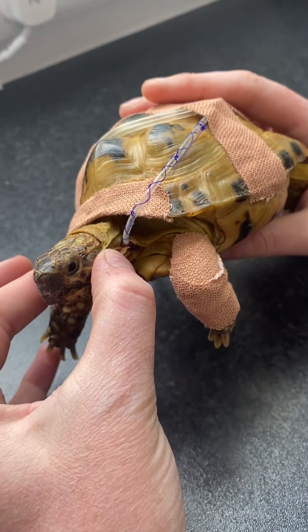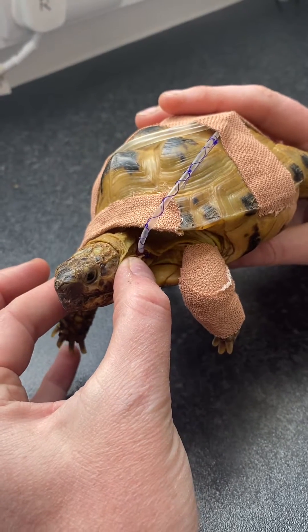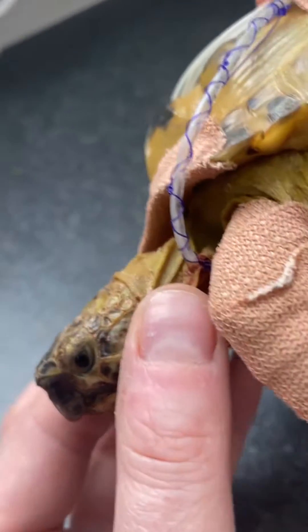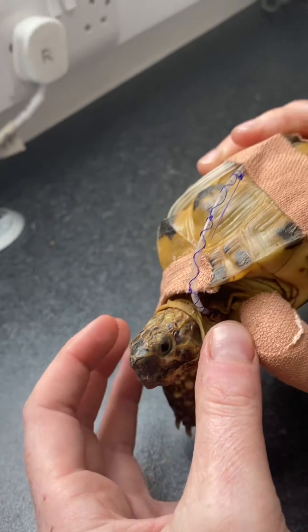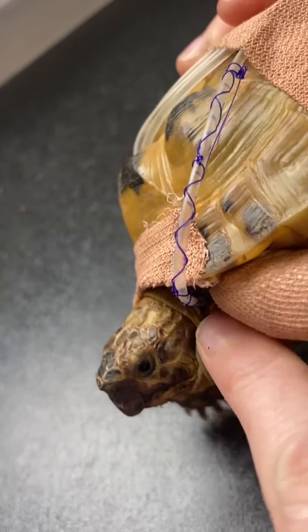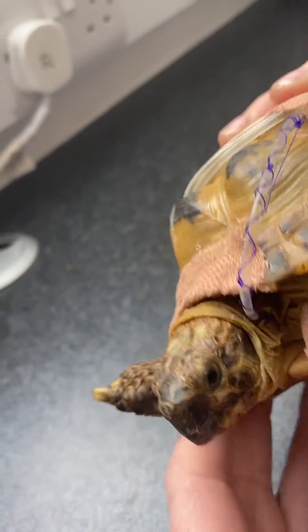We want to make sure that we check this daily — that there's no discharge, swelling, or bleeding. Most tubes have got little numbers on the side. You can see here we're just around about number eight; we want to make sure that tube stays in that position. Keeping it just in front of the eight, we know the tube isn't moving in and out of the neck and is therefore in the right position.